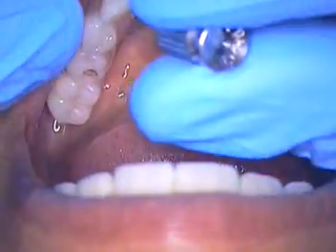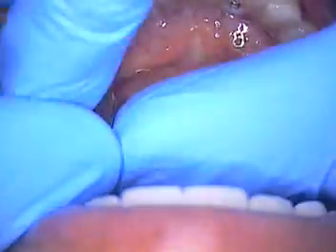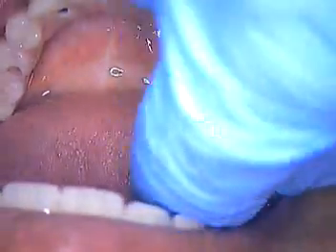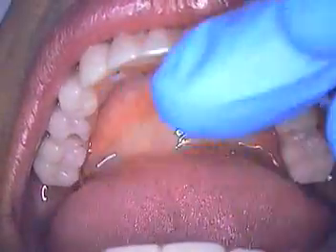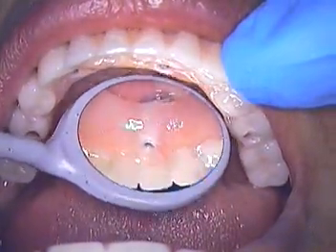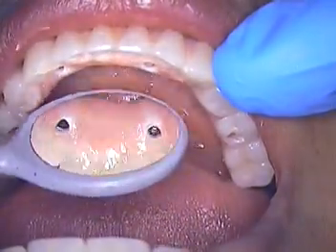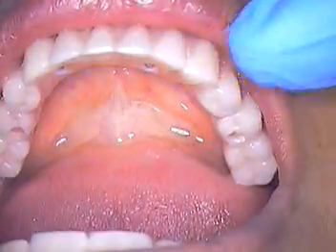Alrighty. Now, what I normally like to do because of temperature, I'll just hand tighten these and I'll walk away for 5 minutes and come back, adjust her bite out, and then come back and hand tighten again, and then get right to placing our material in there. It's that clear. So I'll try to give you a short segment just on that while we wait on our patient. She'll check areas with her tongue, make sure there's nothing sharp, that she's comfortable, and we'll adjust out her bite.